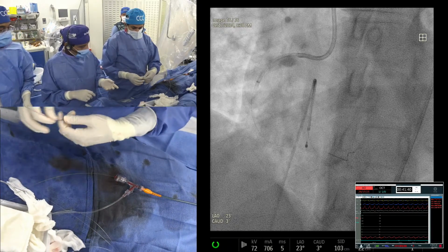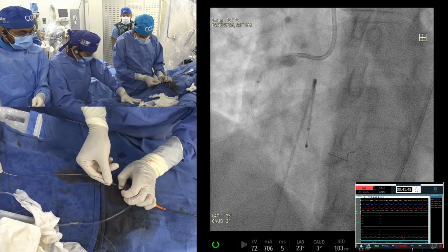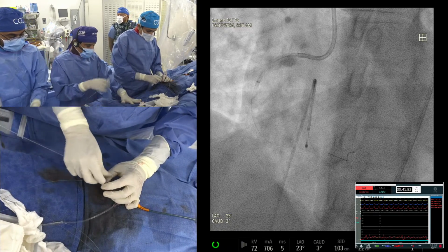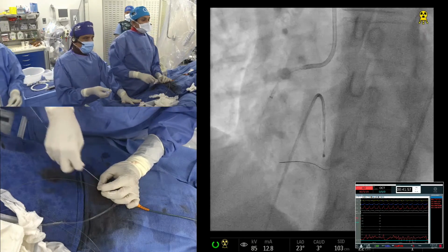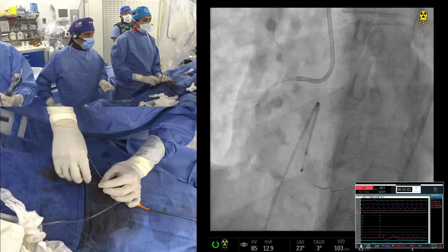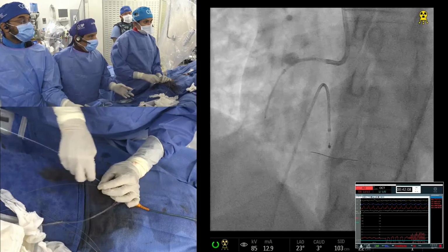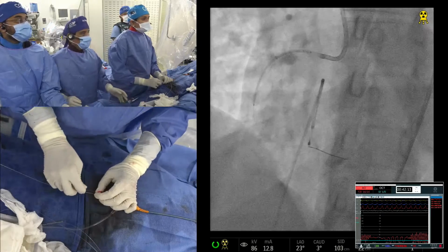So the question comes: what is the role of IVL after rotational atherectomy? In this particular case, I think what we need to do is image, plus or minus, then use a non-compliant balloon, and then decide on IVL. We'll have our algorithm with the paper which Kiski presented at the European Society, which has been accepted. I will share those data next week in our next presentation.